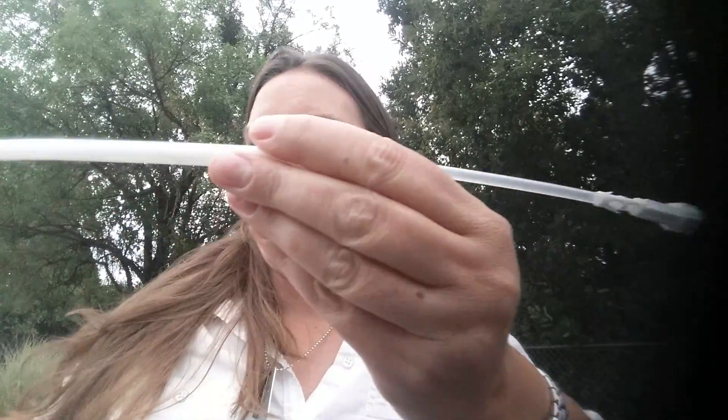Hey, this is Sarah with Brook Bootcamp and today I wanted to talk about the internal fetal monitor. I happen to have one here. I had a medical doctor as a student and she got me lots of fun stuff.